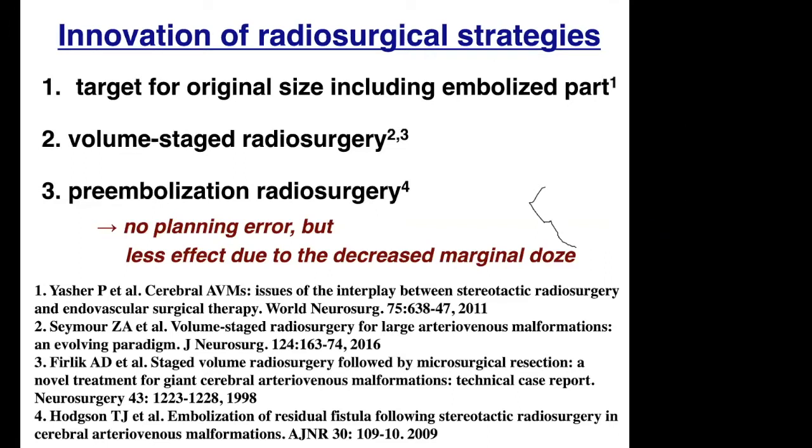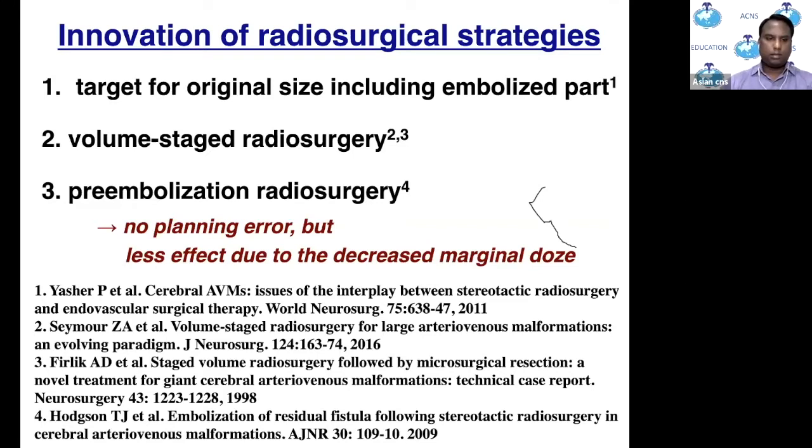We have this aneurysm which looks like a 6.5 mm aneurysm. And the first point. Please continue, Professor. Okay. Yeah.